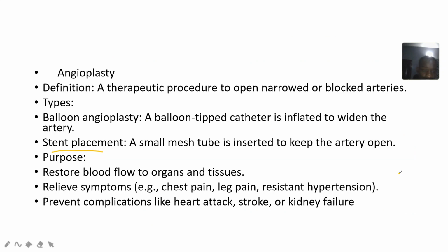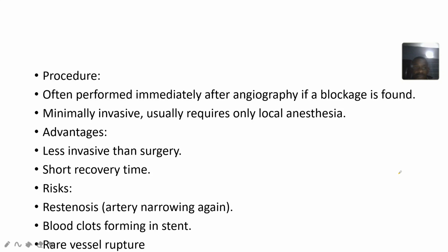The purpose is to keep the place wide so that blood can still flow, to relieve the symptoms the person was facing, such as chest pains, leg pain, and resistant hypertension, and also to prevent other complications that could occur, like heart attack, stroke, or kidney failure. It's often performed immediately after angiography if a blockage is found.